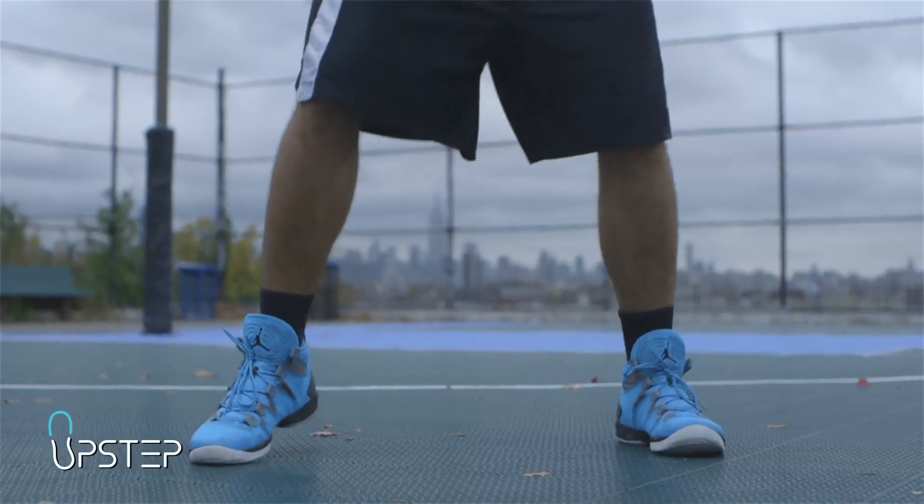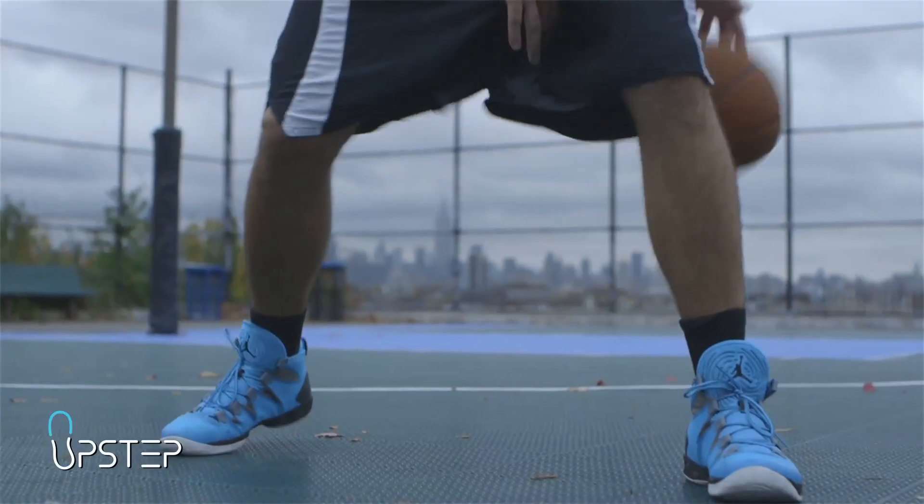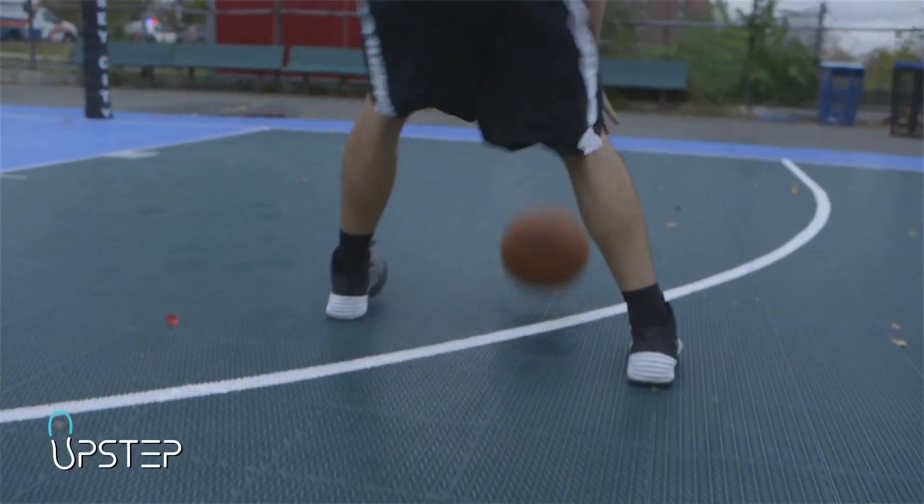We recommend that at first you only use your custom orthotics in the shoes that they were made for. Once you get used to them, you may try them in other shoes as long as they are in a similar style.